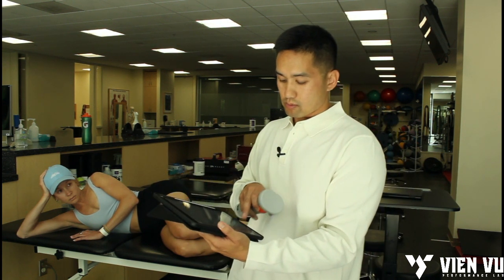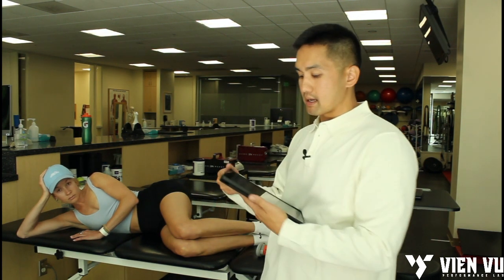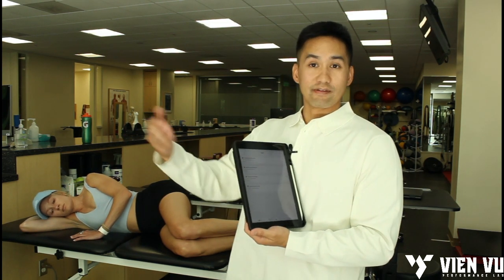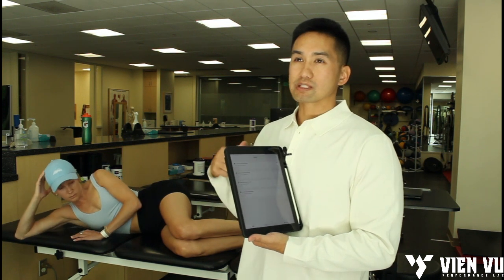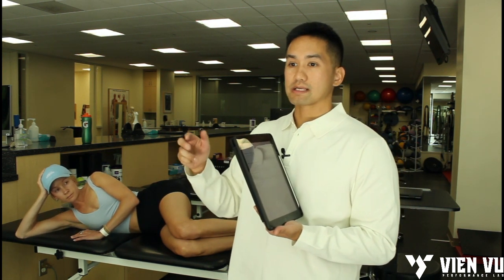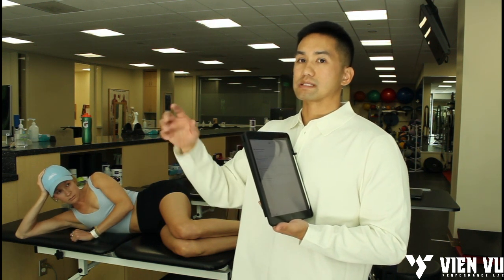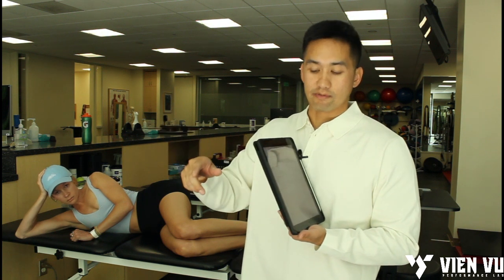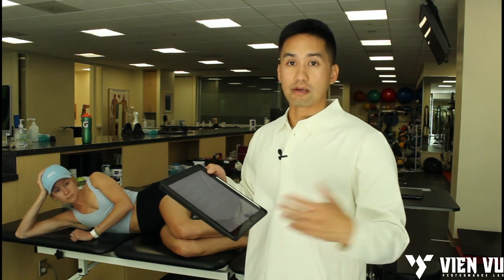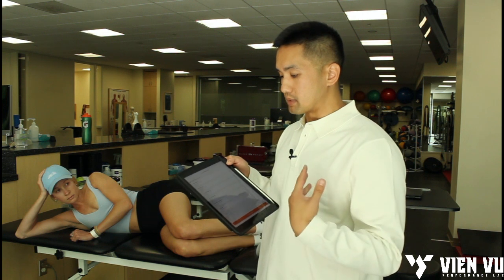Now I'm going to go into Test. I already made some clusters — at the end of the video we'll go over what that looks like. For this one I'm going to use the cluster with just a few tests and test both sides on one test, similar to the sequence I did with the MicroFET. With the Valve Dynamo you can customize the protocol to run through it super quick either way. I'm going to hit the Dynamo Plus Hip Cluster which is the one I built.